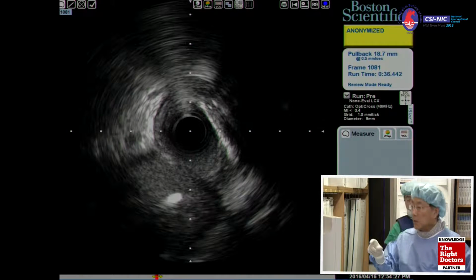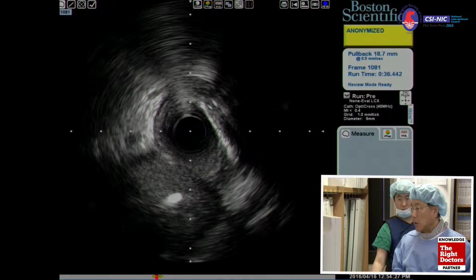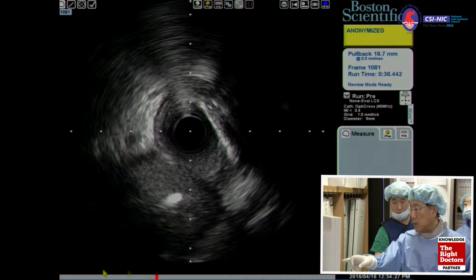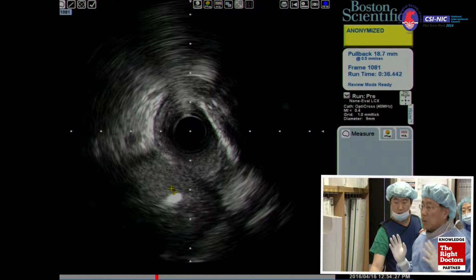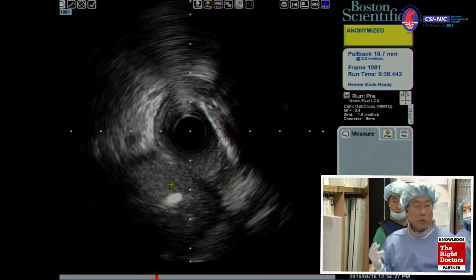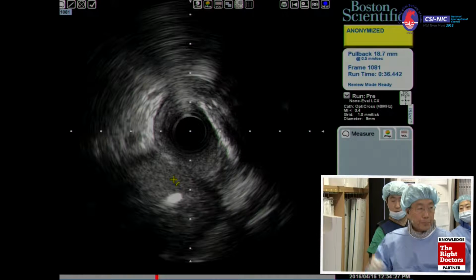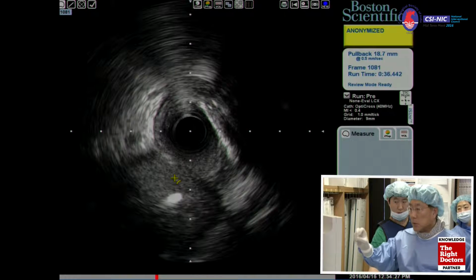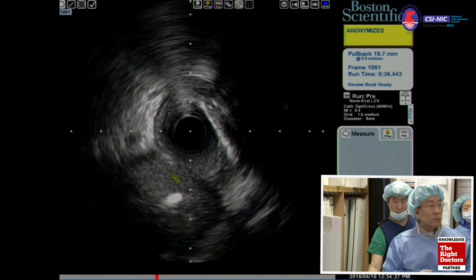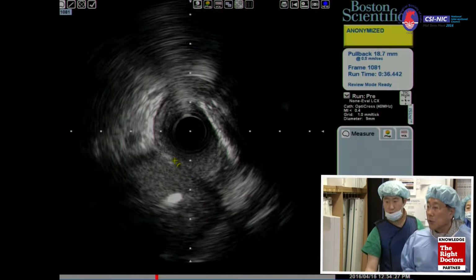That is meeting area from circumflex ostium and LAD. Another wire is at 6:30, 6 o'clock is LAD wire. You can clearly see that, the white one. The circumflex ostial part reference vessel diameter is almost 3.0, more than that. Yes, right. And there is lots of plaque. So whatever the functional significance, anyway, there is some visible plaque on circumflex. Would you show us, vessel size is 3.0?